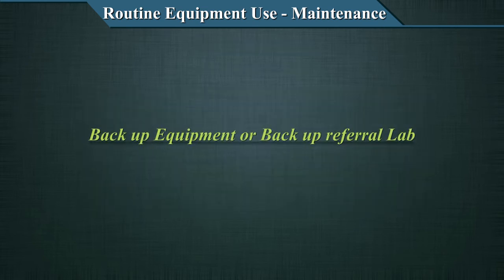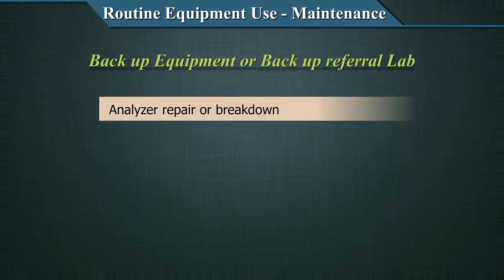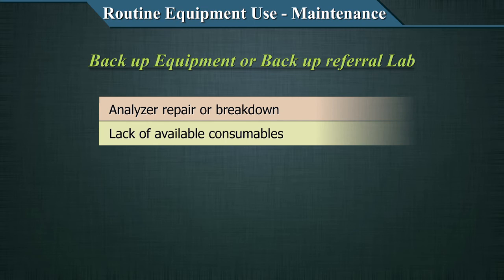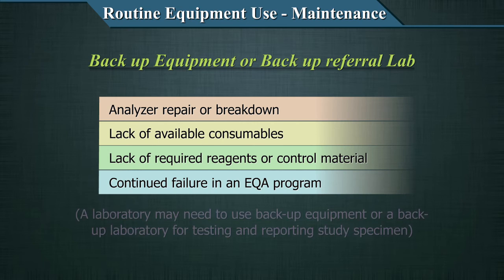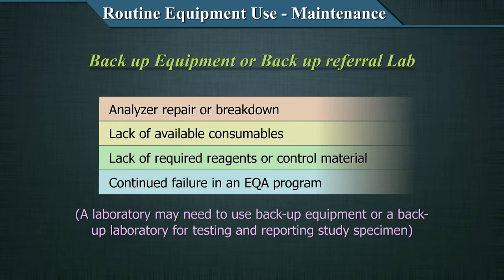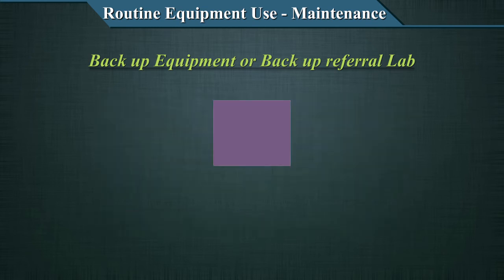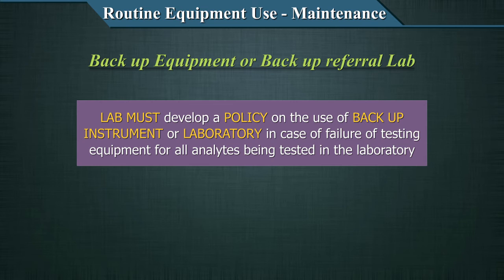The next concept is backup equipment or backup referral labs in the case of breakdown. In certain circumstances — such as analyzer repair or breakdown, lack of available consumables, lack of required reagents or control materials, or continued failure — a laboratory may need to use backup equipment or a backup laboratory for testing and reporting. The lab must develop a policy for use of backup instruments or laboratories in case of failure of testing equipment for all analytes being tested.